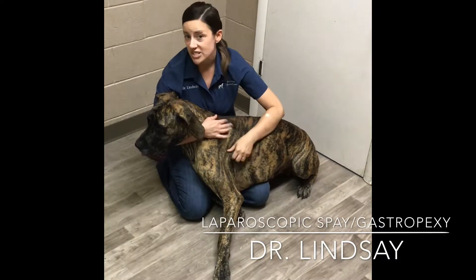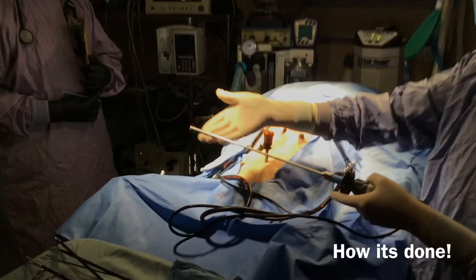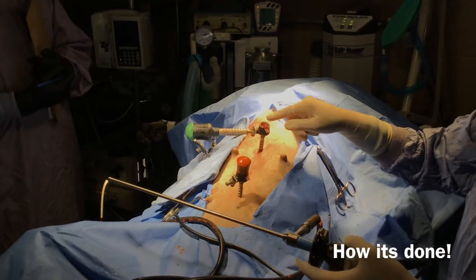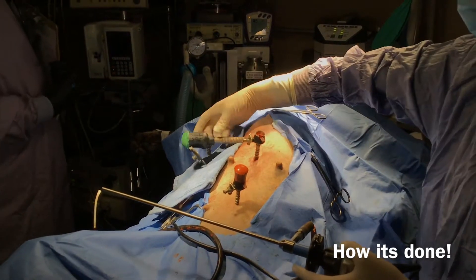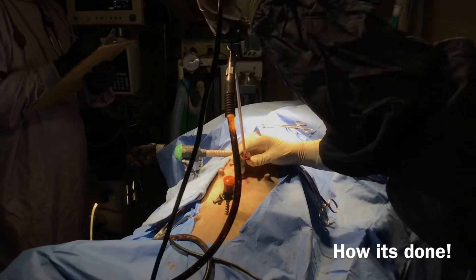Recovery time is a lot faster, there's less bleeding, less pain, and they just do a lot better. This is the camera we use to see inside the patient. These smaller trocars are used so we can insert the camera and instruments inside the abdomen. This bigger trocar is used to remove ovaries through and grab the stomach to tack to the abdominal wall.